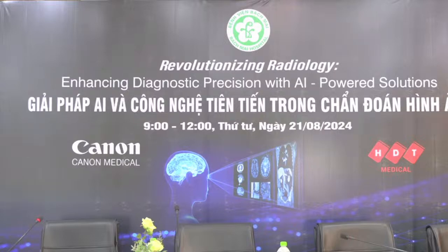Incidentally, we also found that AICE reduces noise and improves image quality in large obese patients with high heart rates. This is a patient whose heart rate was high, I think it was 90 beats per minute, and who had a high BMI. You can see we scanned with 120 kV.